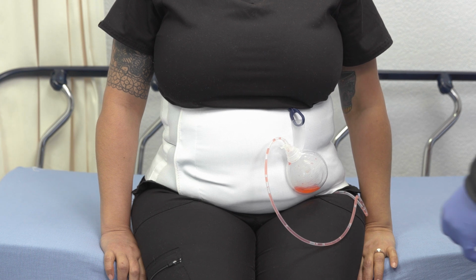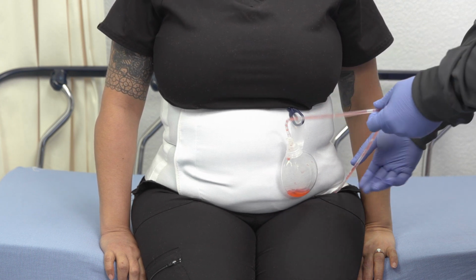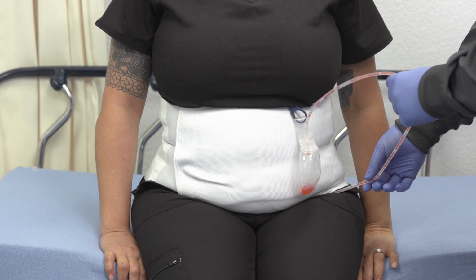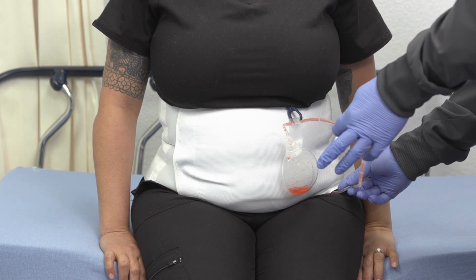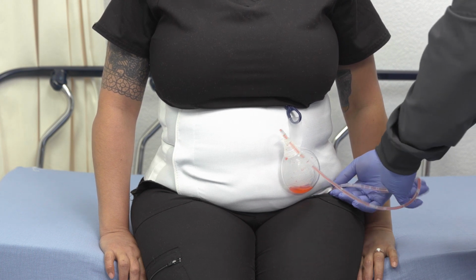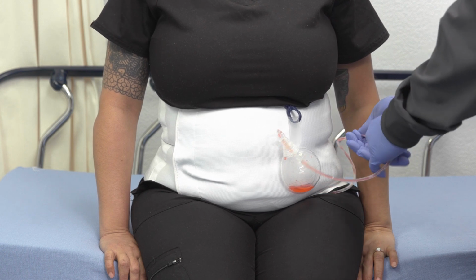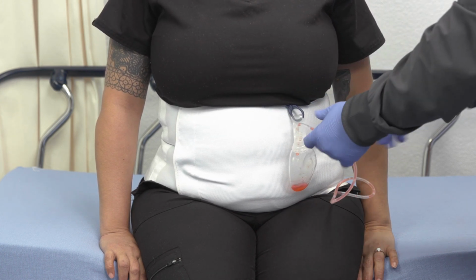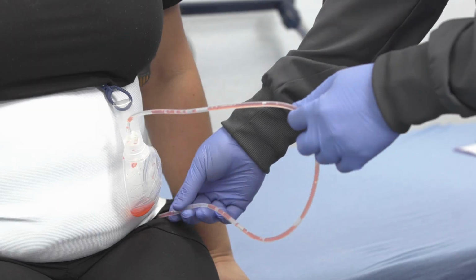Okay, so while you are taking care of your drains and draining them, you're going to want to make sure that you are watching them and ensuring that there are no issues that arise with your drains. So one of the issues I'm going to go over is if there is a clog or a block in the tubing. So while you're going through the milking process, if you notice that that fluid is not moving from the tube to the bulb, then that means that there could potentially be a block or a clog somewhere within the tubing itself. However, don't panic right away.